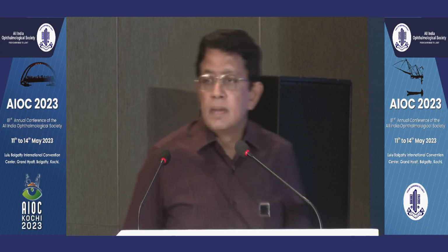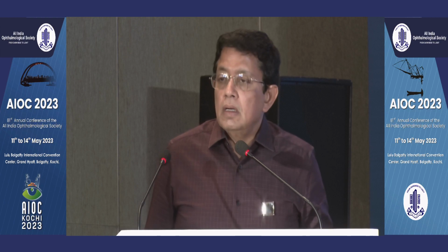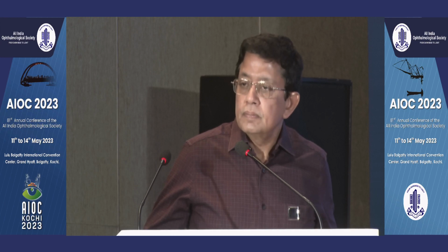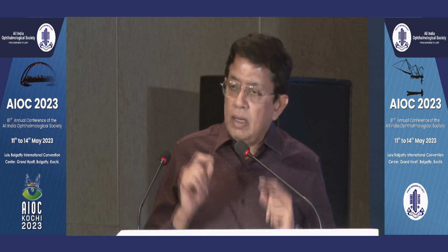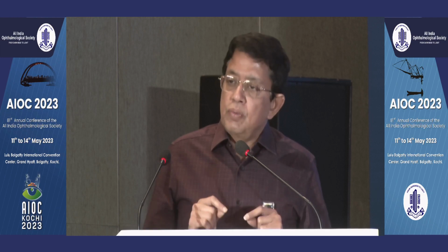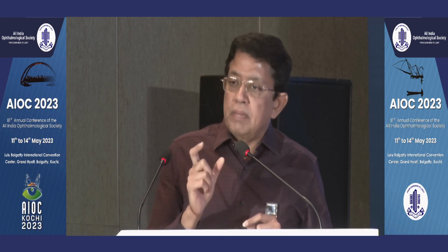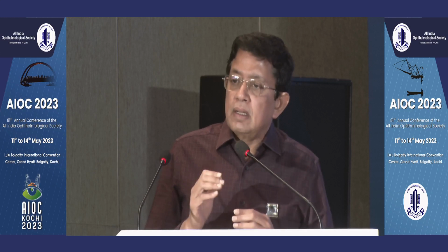Dr. Ramu, with regards to sizing of the lens, once you do your white-to-white measurements in the theater, do you have some other backups done in the diagnostic room with which you compare, and what's the kind of comparison you normally find? It's a very relevant question in the sense that we do both with the digital calipers as was shown under the microscope, and then also we use either a Topolyzer or an OBSCAN to measure the white-to-white measurement. And ideally, both these measurements should be quite close to each other. They're never the same.